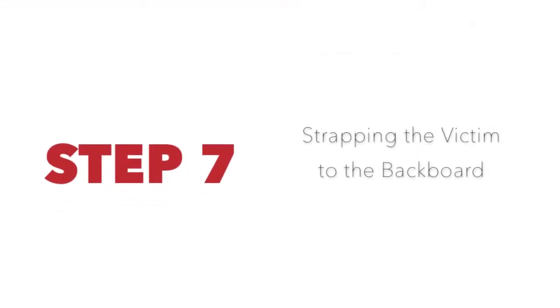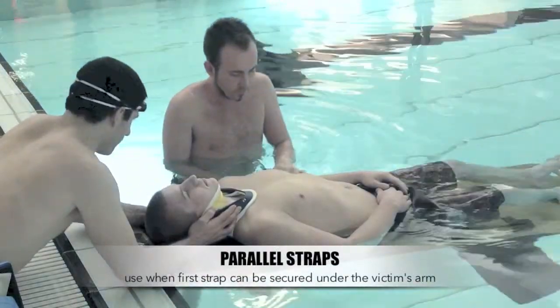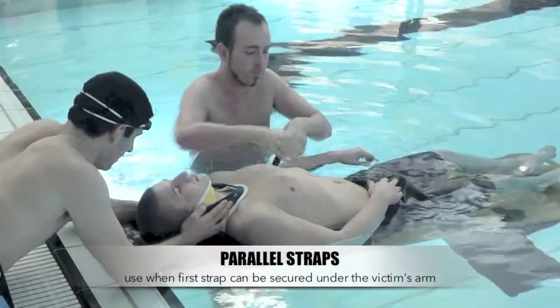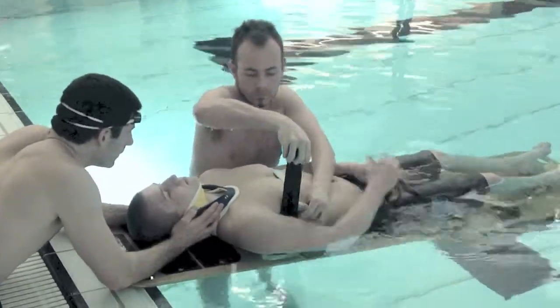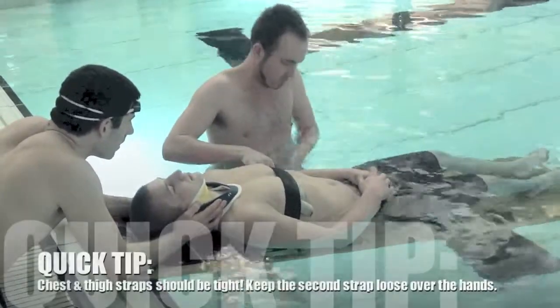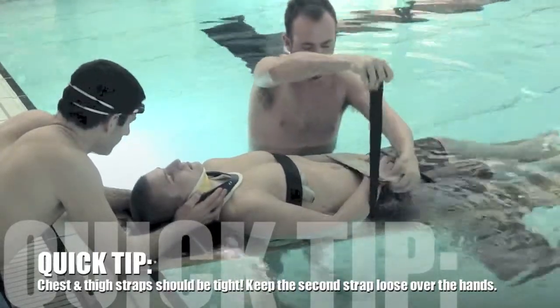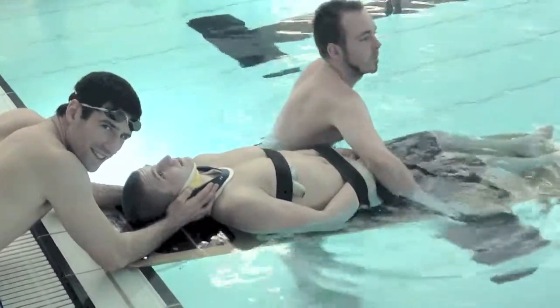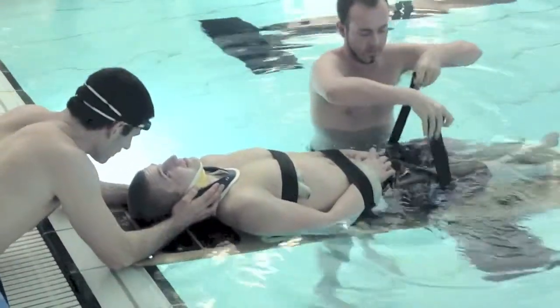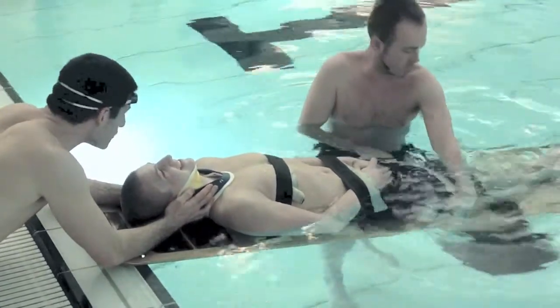Step 7. Strapping the victim to the backboard. If the victim is high enough on the board, the first strap should be at about armpit level. Secure this strap under the victim's arms and tightly across their chest. Work your way down the board, loosely securing the victim's hands under the second strap and tightly securing their legs under the third strap. Keep in mind that the victim's height will determine where the straps lie on their body. Be mindful of their comfort, but be sure their straps are secure enough that there is no movement during or after the backboarding process.